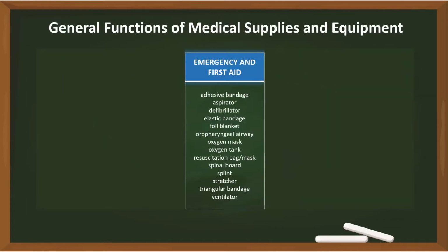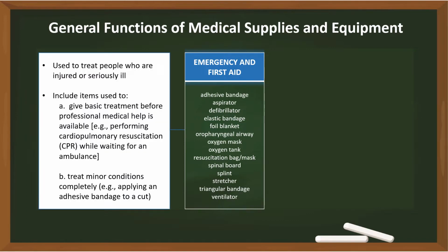Now let's talk about supplies and equipment for emergencies and first aid. These items are used to treat people who are injured or seriously ill.